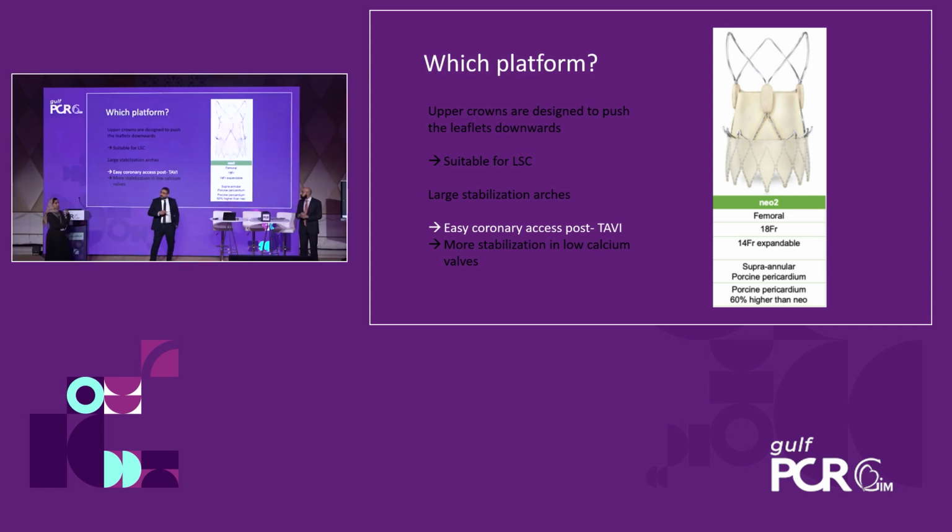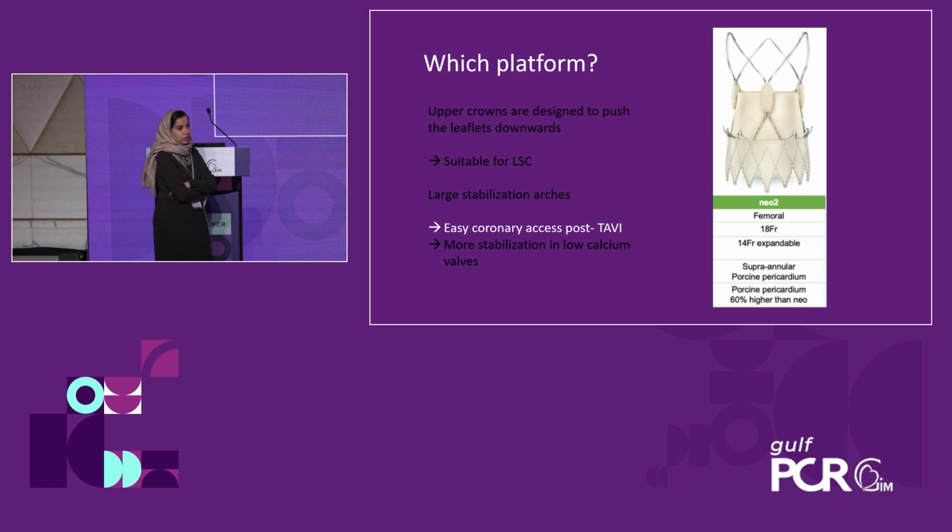And you're going to hear a lot about the predilatation, how to do it, also later, because we're just going to emphasize how to implant the valve correctly to avoid any valve dysfunction in the future.